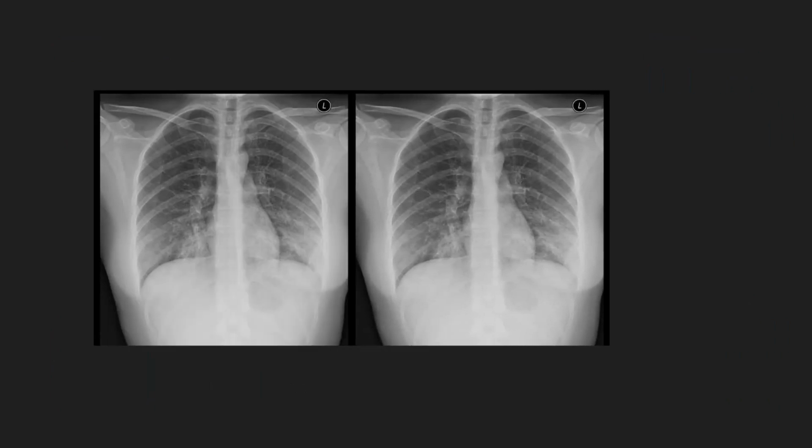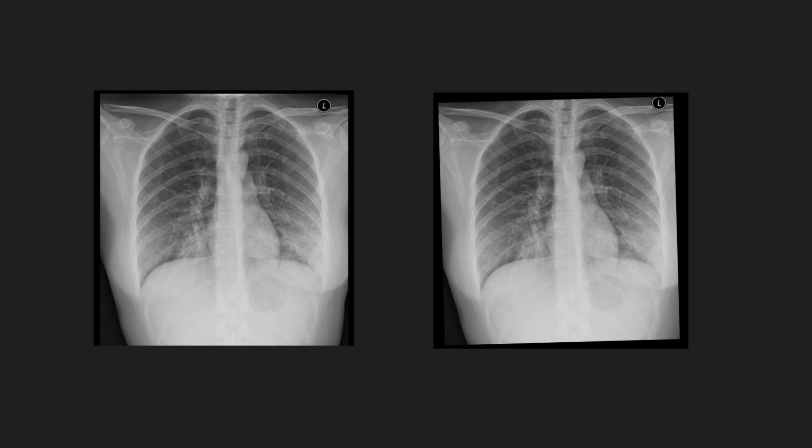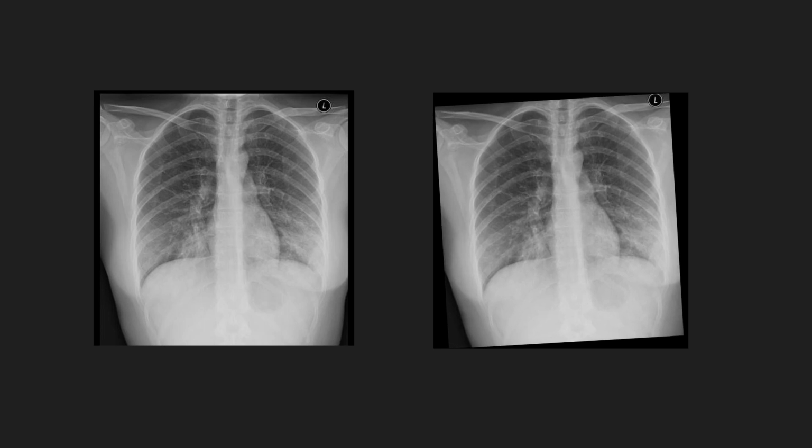If we did that, then we would run into the same issue of having bias again, because we would be training on the same picture twice. What we have to do is data augmentation. If we randomly do a slight rotate of a float value between -4 to 4 degrees on an x-ray, it can simulate a doctor maybe scanning the x-ray slightly off. This will be enough for a neural network to discern the difference. The only problem when rotating the x-rays is that the images will generate black sections like this. To fix this, we need this kind of math to get the max area of the image.